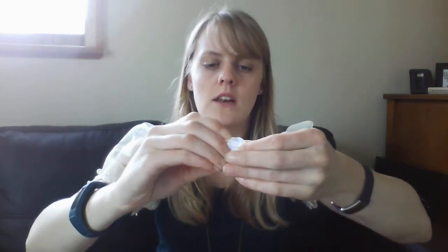In the back I also have one of these wee doofers for my pump. That's just, if I can get it off, bits that plug into your pump. This one you plug into the end of your pump lead, which stops the insulin going all over your bag if you take your pump off and don't suspend it. This one just stops sand and grit getting into your pump clip if you're at the beach or something. I rarely ever use them, but they're there if I need them.